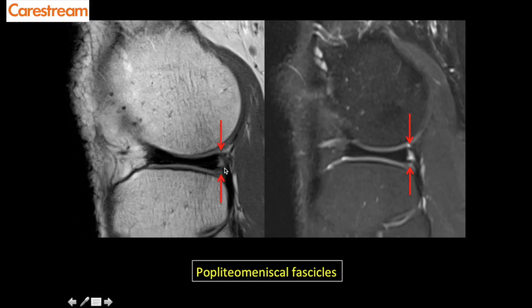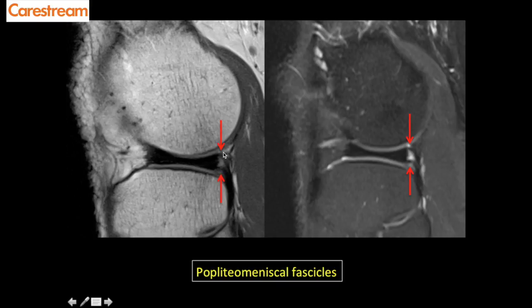The third normal structure that can look like a tear is the popliteal meniscal fascicles. There may appear to be a tear between the periphery of the posterior horn of the lateral meniscus and the capsule, but these are thin linear hypointense bands — approximately three popliteal meniscal fascicles — which connect the posterior horn of the lateral meniscus to the popliteal tendon sheath. Normal fluid signal here should not be mistaken for a tear. Importantly, in cruciate ligament injuries, popliteal meniscal fascicle injury should be identified and reported.